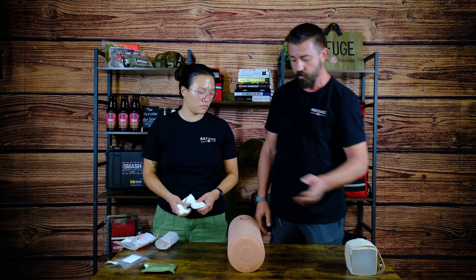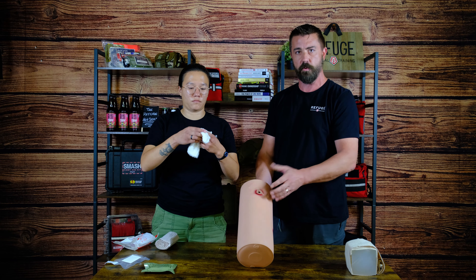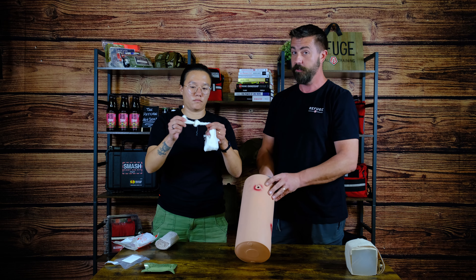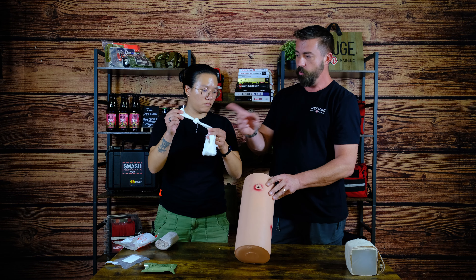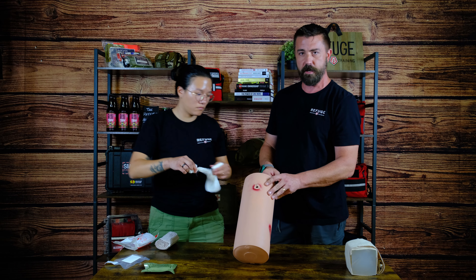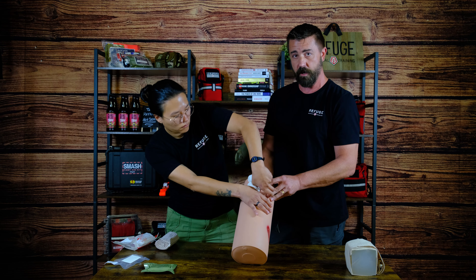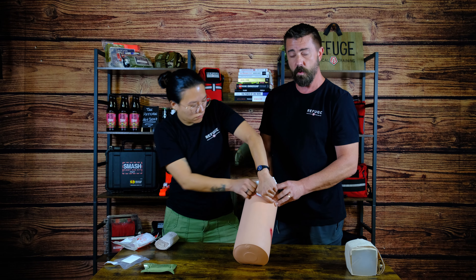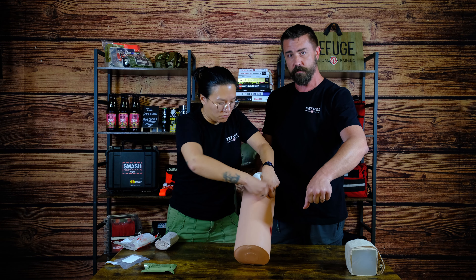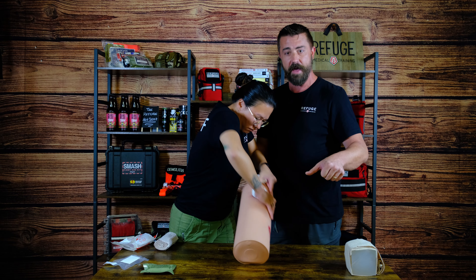However, if you are dealing with a penetrating wound — something like a gunshot wound or an impaled object that's been removed, hopefully not by you — you should not do that. You want to ideally start off with what I call the power knot. Just tie a little knot in the end of the gauze, and that allows you to drive it all the way to the source of the bleeding. So you're going to go in deep, and once you've reached that point of bleeding, you're going to maintain pressure on that at all times.